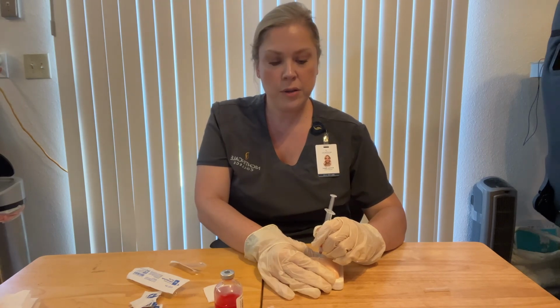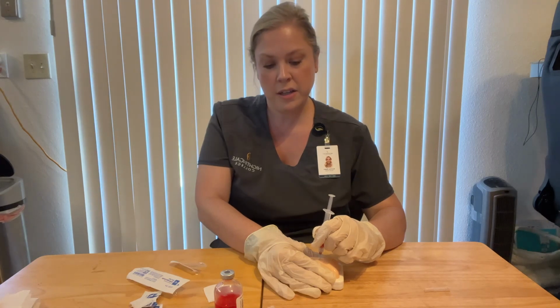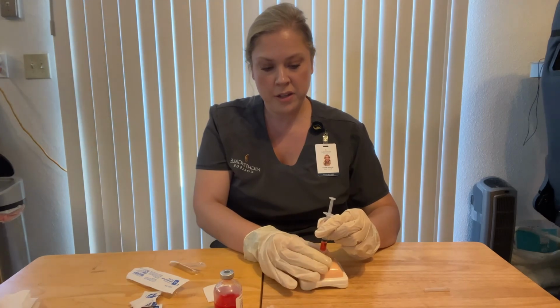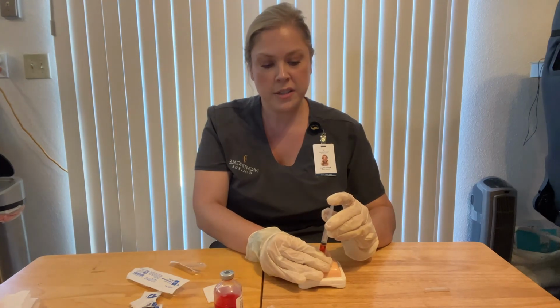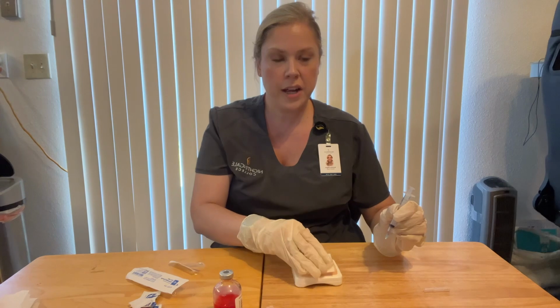However, with other sub-Q injections, we would release the pinch with our non-dominant hand, and then grab the bottom of the plunger to stabilize that injection while we were injecting, which I'll do that now. I'll demonstrate that. So we'd let go of that pinch, hold the bottom, and then inject slowly. We want to inject heparin medication over about 30 seconds. Perfect. We'd want to withdraw that, place gauze over it.